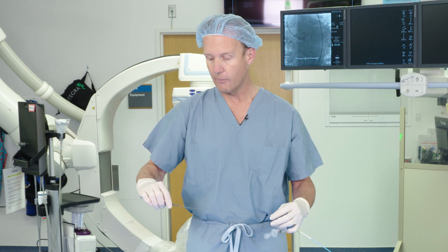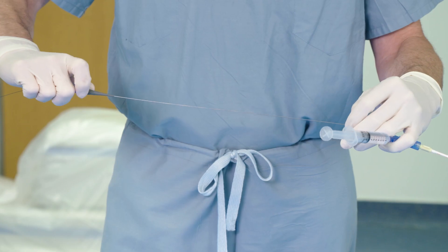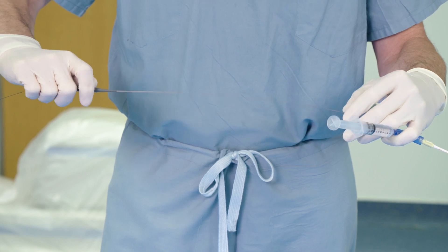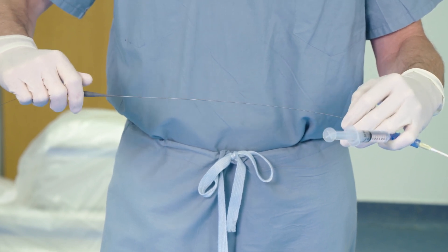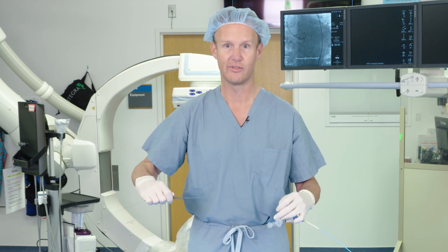This is not the only way this catheter is used. The package labeling states that you turn it clockwise and get about 10 clockwise turns in one direction, at which point you stop and relieve the torque on the catheter. In general day-to-day use, I don't necessarily follow this strictly.